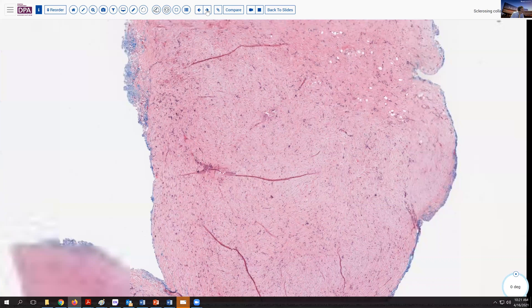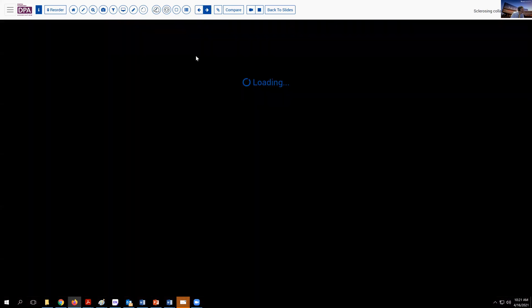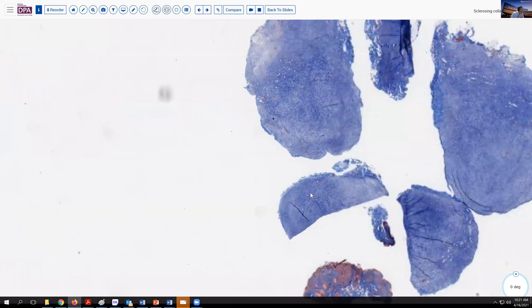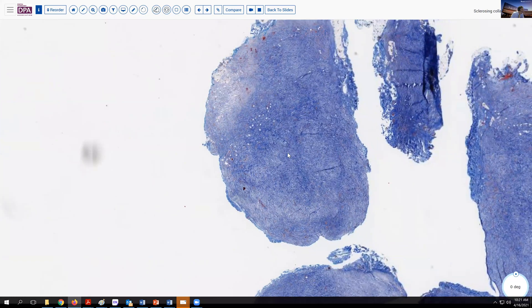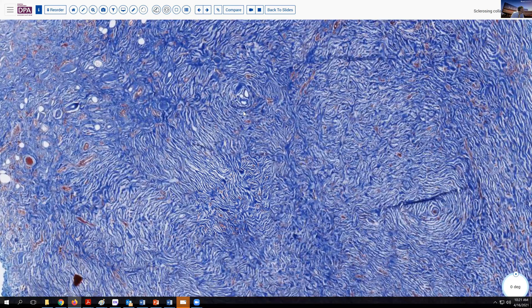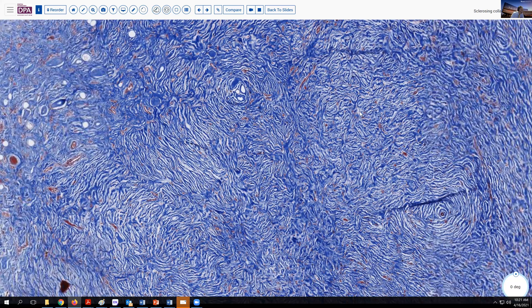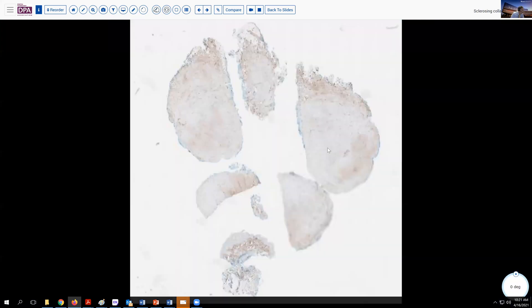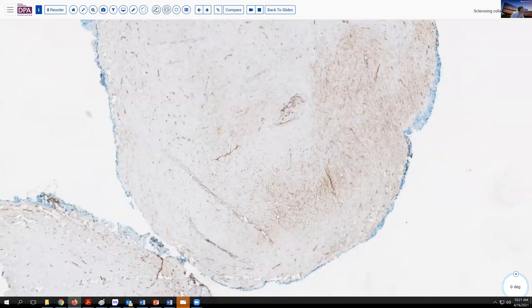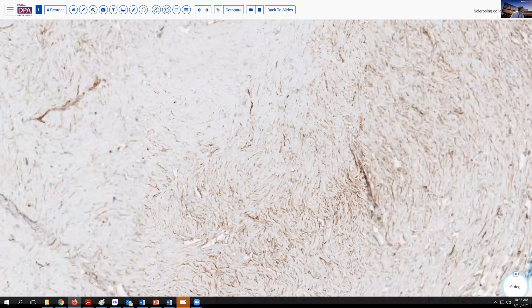Just to verify that we're dealing with collagenous tissue, my colleague who worked this case up ordered a nice trichrome stain, which shows about as beautiful a blue staining pattern as you can imagine. Look at this nice whirling and storiforming pattern with the lamellations and intervening paler areas, all staining nicely and solidly blue. We also did a CD34 stain, which helps highlight the vasculature but also shows that some of these cells have a little bit of CD34 reactivity.